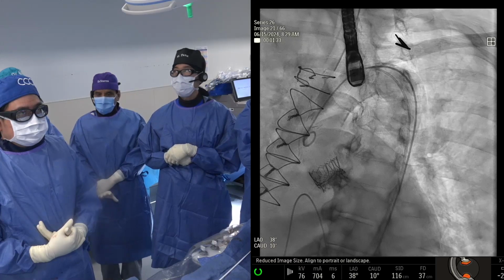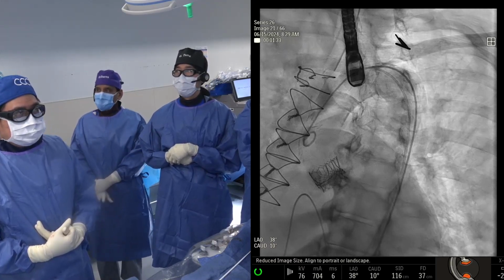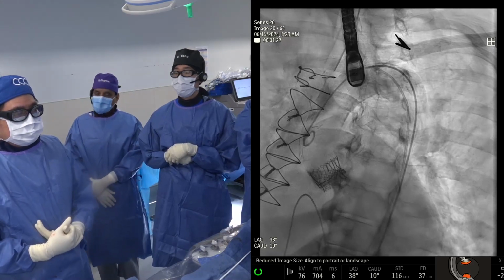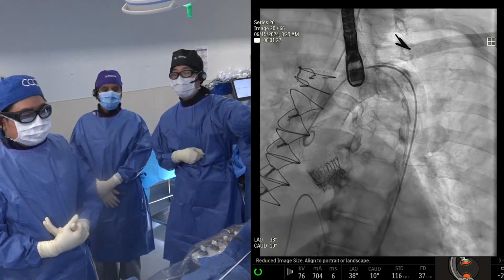We are learning to move away from it, and in rare cases we'll do it pre-dilation if needed. So just to make the message clear, don't make it a routine habit, even with fracturing a valve. Don't fracture it if not needed. I want to show this. We want to actually show you a final aortogram.